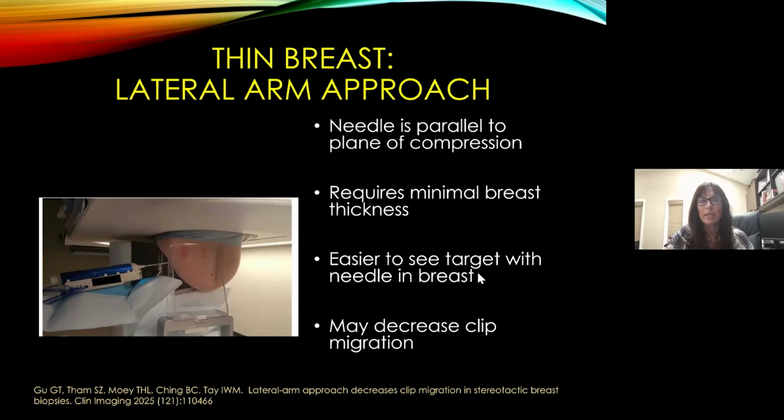Manufacturers have now developed another approach to address the issue of a thin breast rather than changing the length of the trough or the dimension of the dead space or tip at the end. There's something called the lateral arm approach. In this case, the needle is advanced parallel to the plane of compression. So typically we are perpendicular, as I mentioned, and there is a hole, a window in this compression paddle, and the needle is approaching the breast in this direction. Again, kind of along the z-axis.